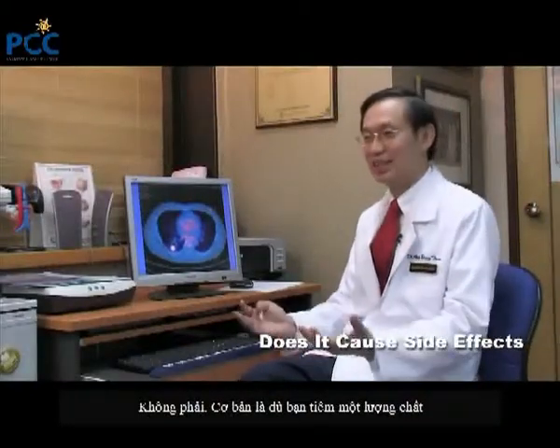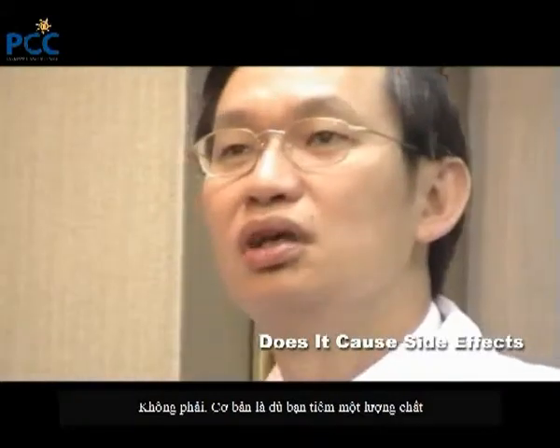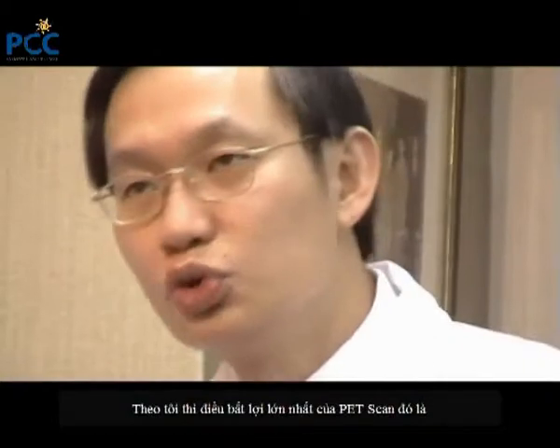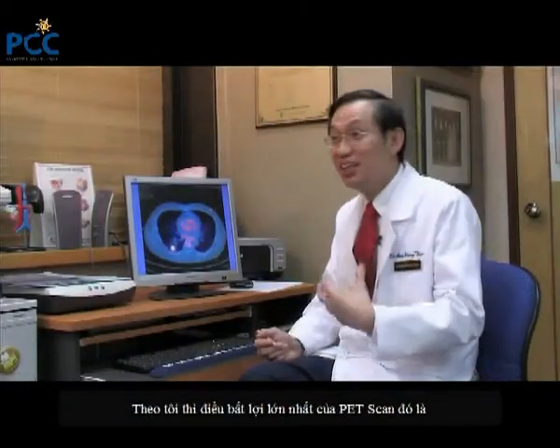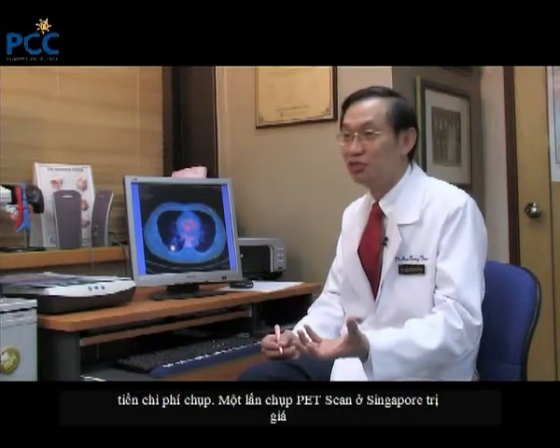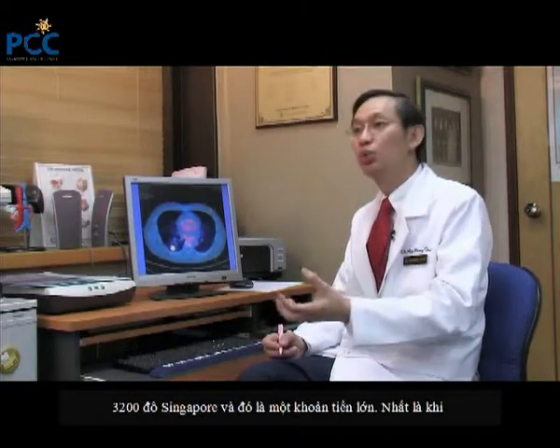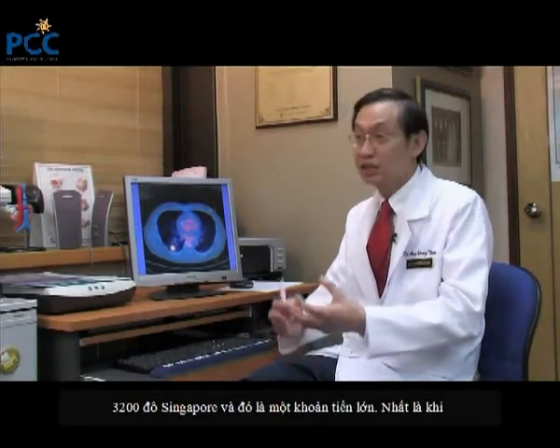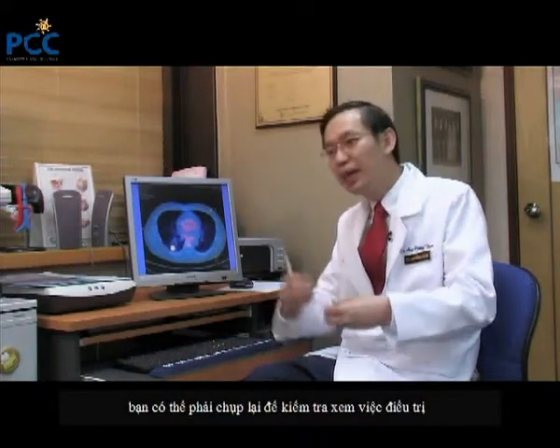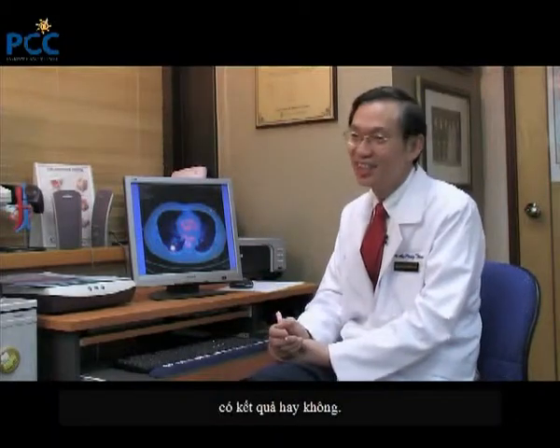No, it doesn't. I mean, basically, you are injecting a tiny amount of FDG, which is a radioactive substance, but it is not harmful to the body. All right. To me, the biggest side effect of a PET scan is really the cost involved. A PET scan in Singapore costs 3,200 Singapore dollars, and that's a big sum of money to pay, especially when you may need to repeat it again to establish whether the treatment is working or not working.